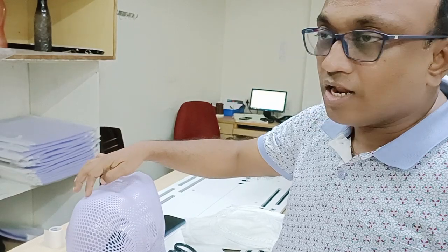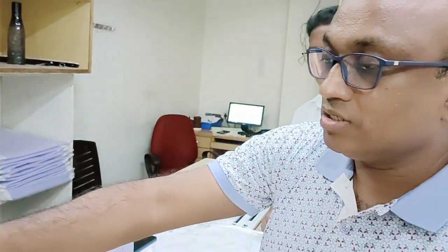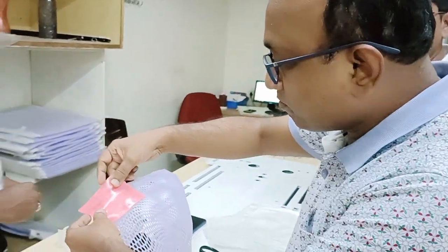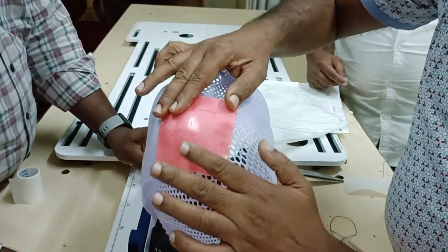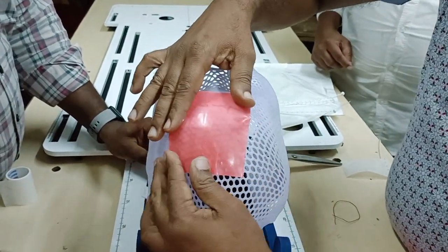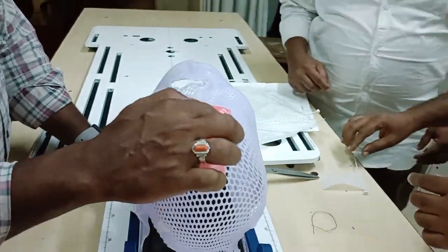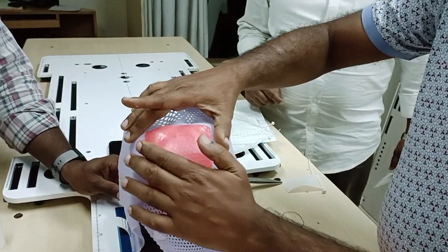For example, if the tumor is in the scalp, you make and paste the molded wax in the scalp area. You can see this is the wax area, now fixed to the mask. The tumor will be underneath it.